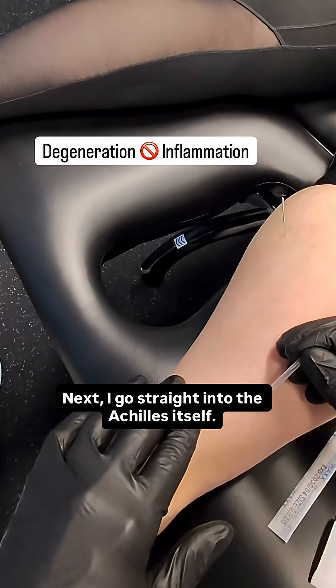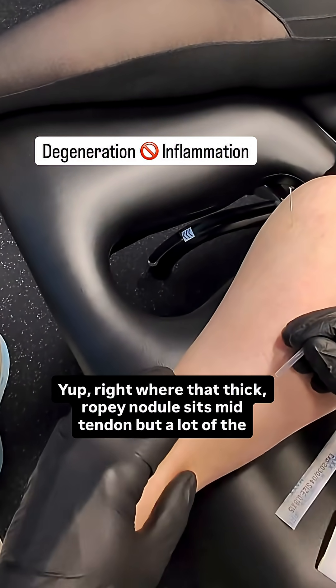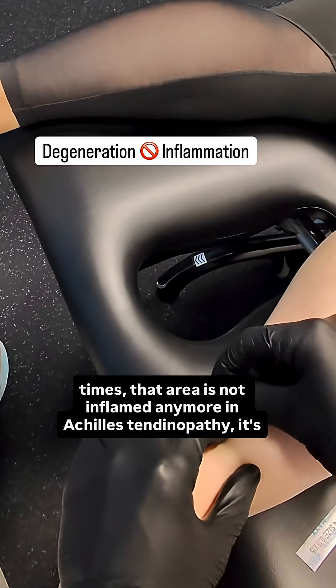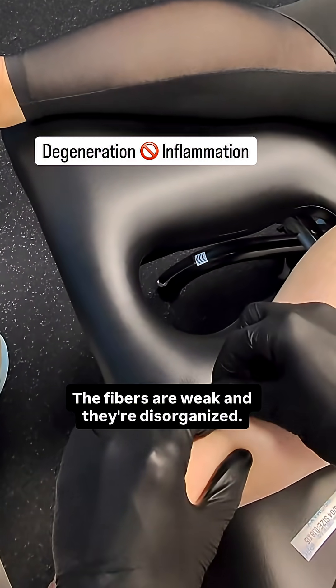Next, I go straight into the Achilles itself — right where that thick, ropey nodule sits mid-tendon. But a lot of the times, that area is not inflamed anymore in Achilles tendinopathy. It's actually degenerated. The fibers are weak and they're disorganized.